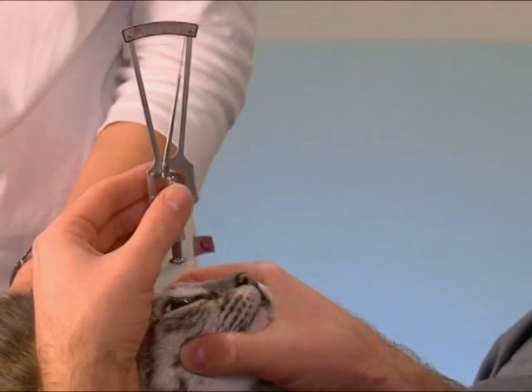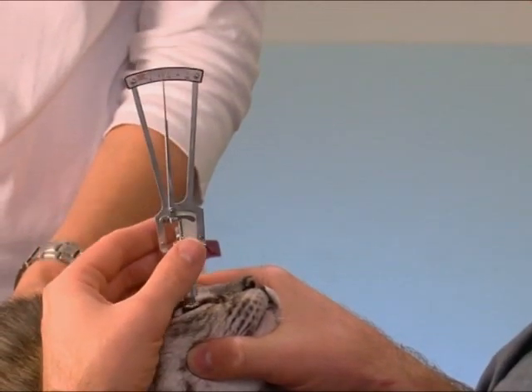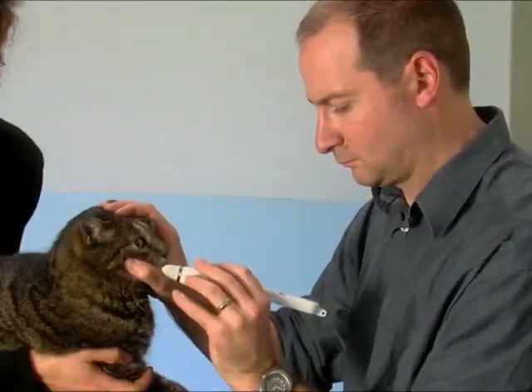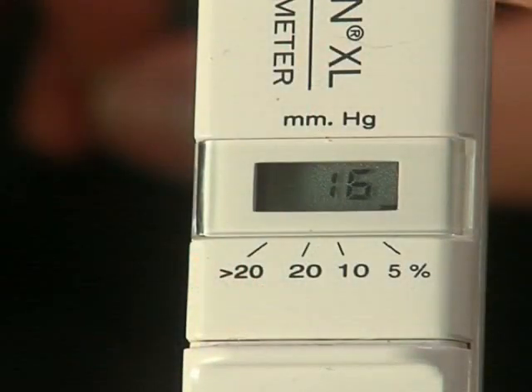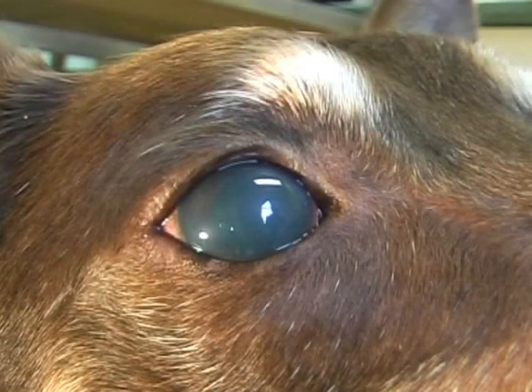For measurement of intraocular pressure, the two main instruments used in veterinary practice are the Schiotz tonometer and the Tonopen. Normal intraocular pressure in cats and dogs is generally between 10 and 25 millimeters of mercury, though some physiological variation occurs. A sustained increase in intraocular pressure is the defining feature of glaucoma.